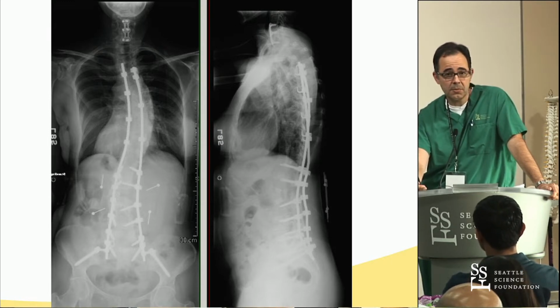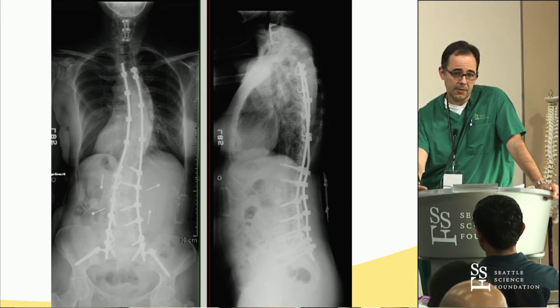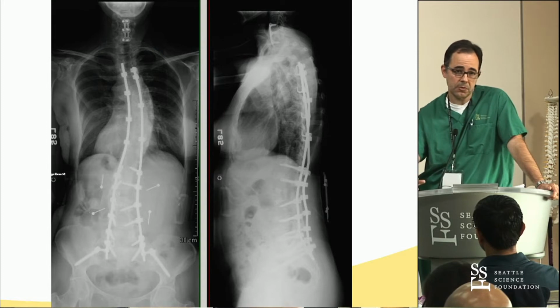Very often it does improve, but very often after it improves, it gets worse. And then at that setting, I go ahead and put in SI joint iliosacral screws.